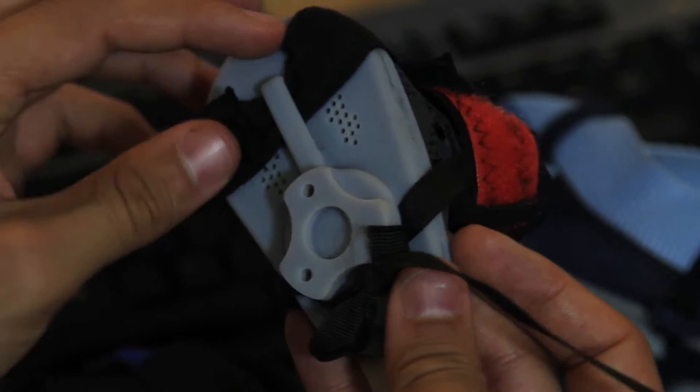This is the fun part. We've created the design in Inventor, we've sent it out to Objet, they 3D printed it for us, and now we have all the parts back. Now we basically just get to put it together.